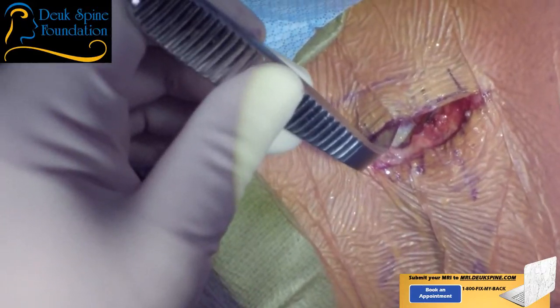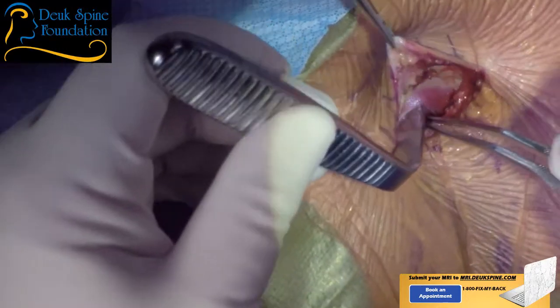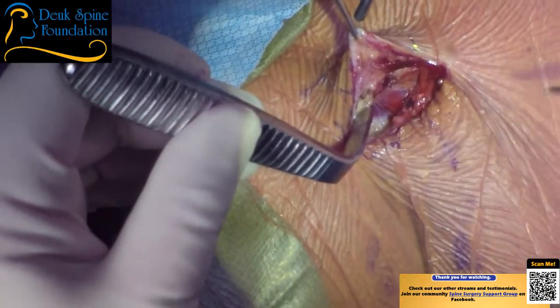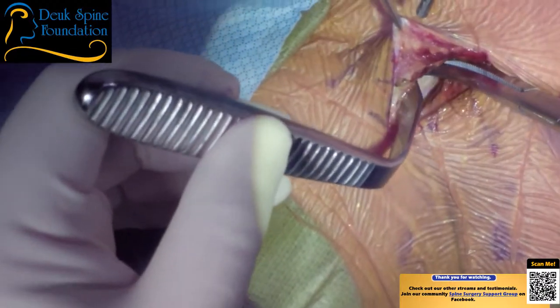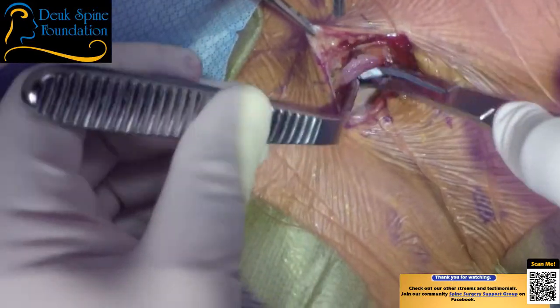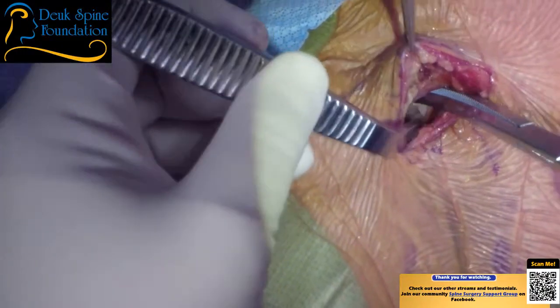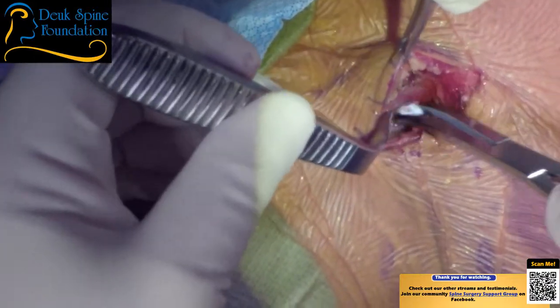Bipolar. Come on, Luis, get it in my hand. So the bipolar is used to coagulate or cook tissues, mostly little blood vessels, kitty, so that there won't be the bleeding. You can't just do surgery and not stop the bleeding. If you don't stop bleeding during surgery, the patient will bleed to death. So it's very important during surgery that you have good control over the bleeding.